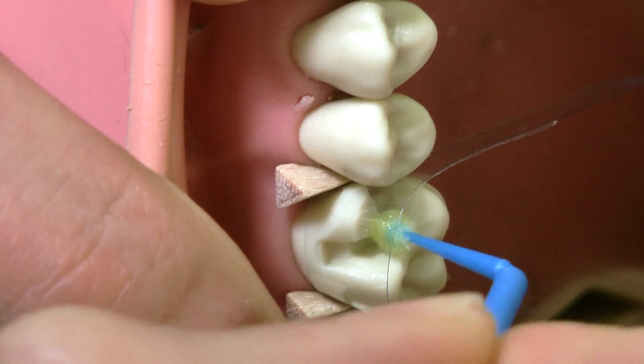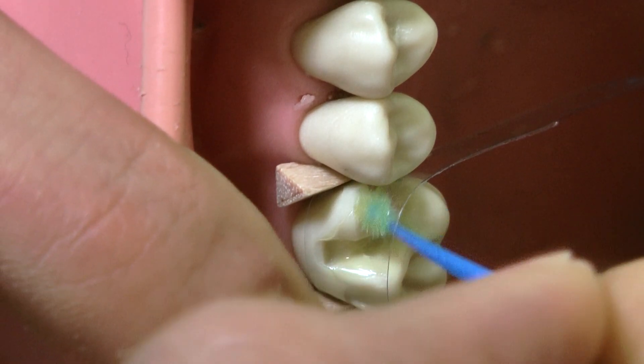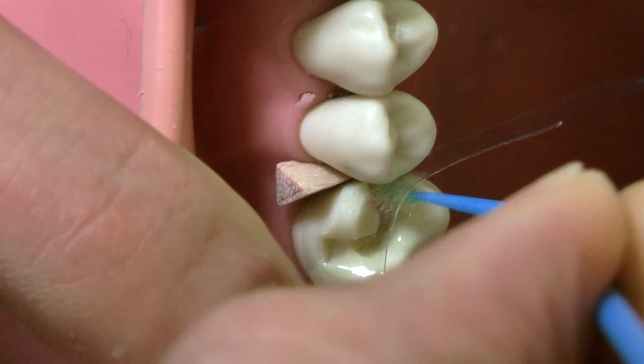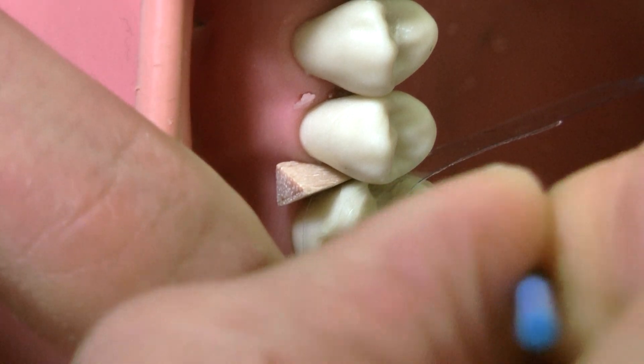We're applying bonding nicely with the micro brush inside — over the bevel, all around the cavity. We do not etch here because it's a plastic tooth and it doesn't require etching, and neither does it in the exam. Curing for 20 seconds.